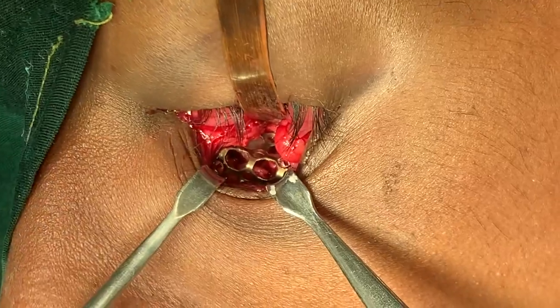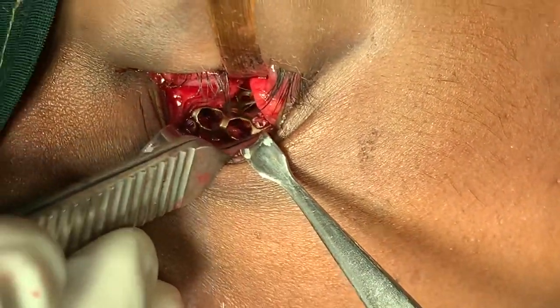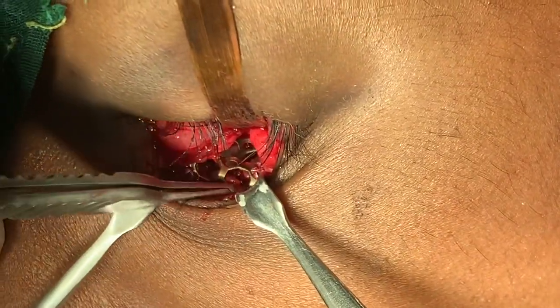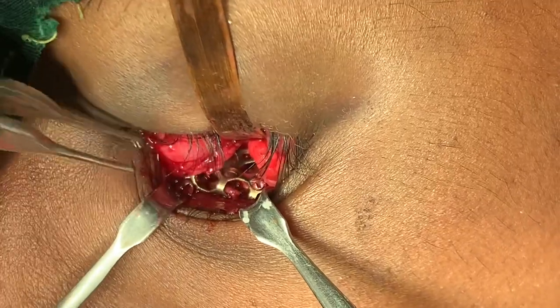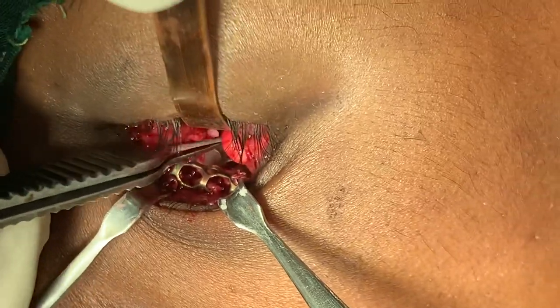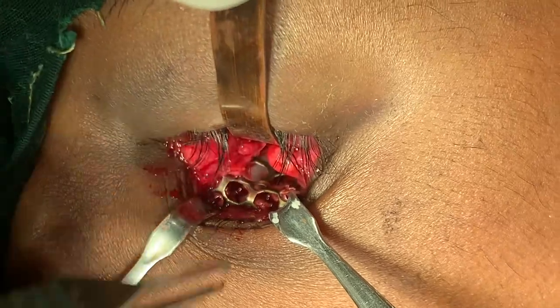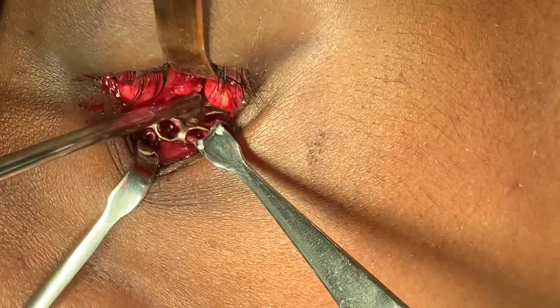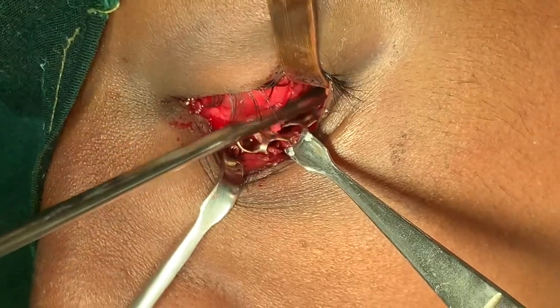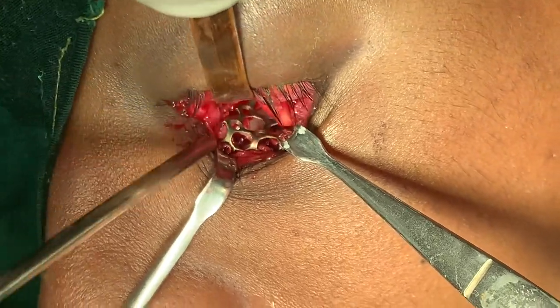Okay, so you can see that this bone here is formed. That's the infraorbital rim lateral aspect. Infraorbital rim medial aspect is also formed. But in between, there was a centimeter long bone that was fractured and also displaced inferolaterally. And you can see that now just beneath the mesh that I've placed in. So I'm going to show you how the reconstruction has been done. That's the orbital floor on this side, the normal one, which is not fractured. Likewise, I've done the dissection to this side, normal one.